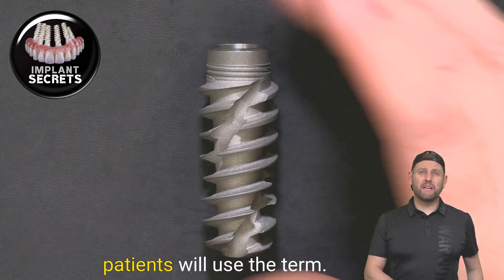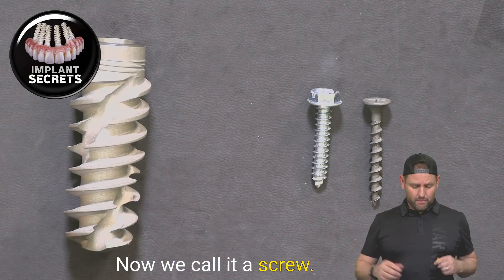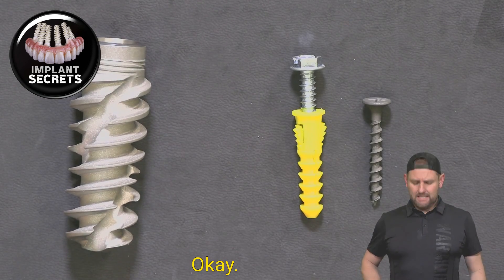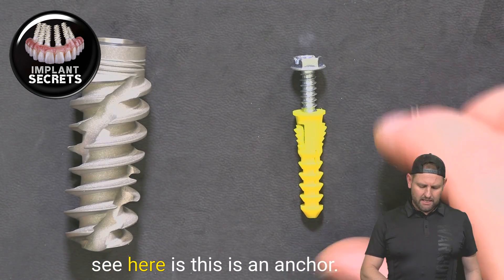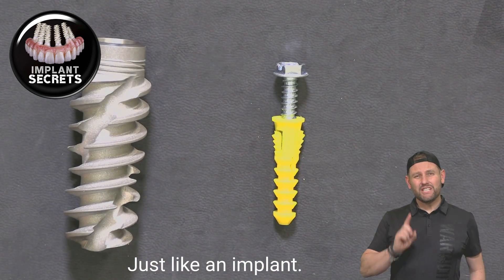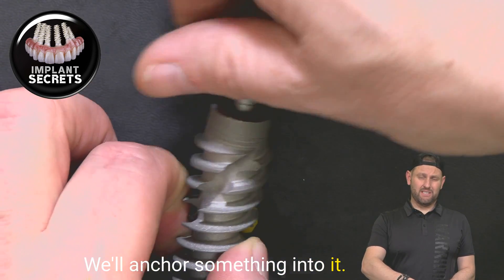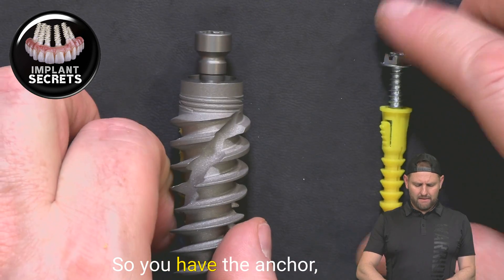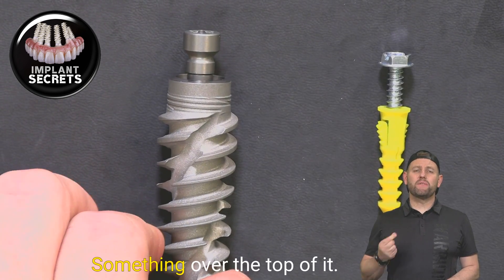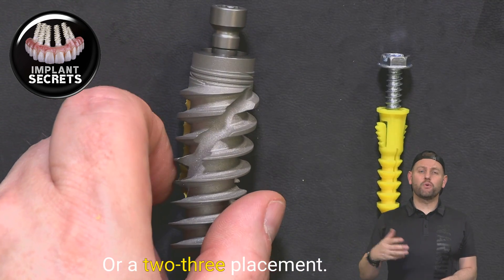A lot of times patients will use the term a screw in place of an implant. If we call it a screw, this would probably be the most accurate way to represent it, because what we see here is this is an anchor and a screw goes into an anchor — just like an implant and a screw will anchor something into it. So you have the anchor which is the implant, and a screw that tightens down something over the top of it, attaching a prosthetic crown or a tooth replacement.